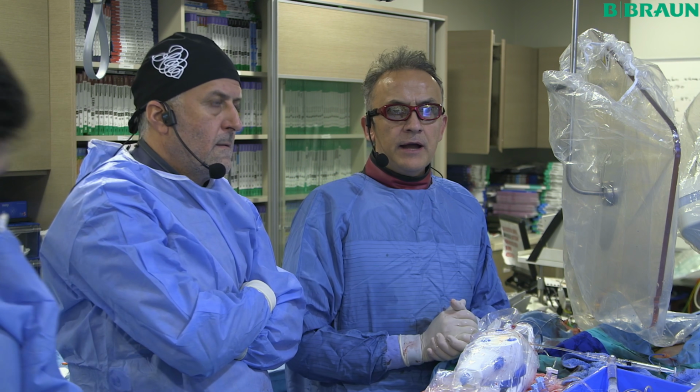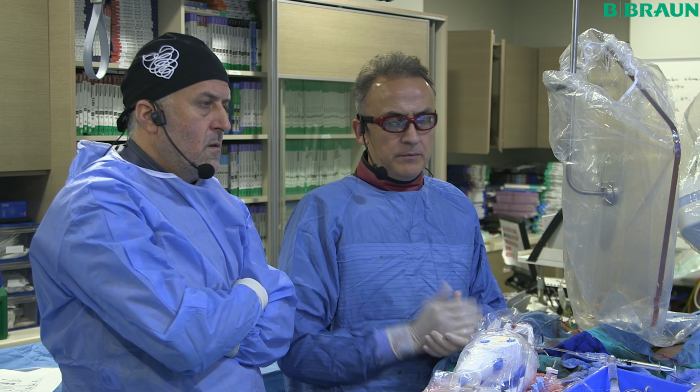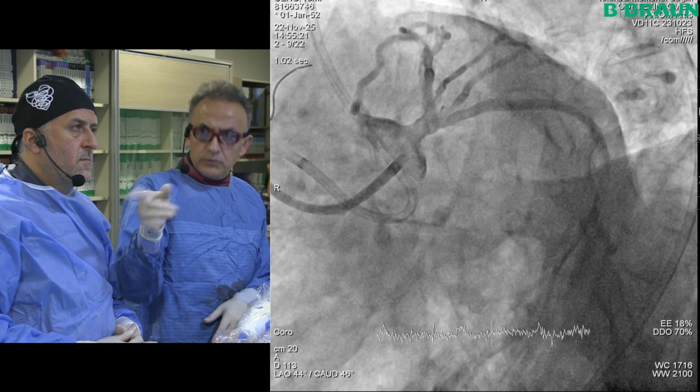We have an LAD calcified lesion and an RCA CTO for our session. I'm Margaret Tekin and my coworker is Ahmet Shakir. Let me show you what we have.